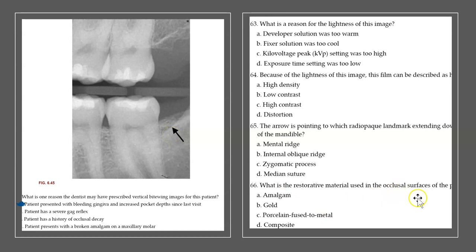Looking at the restorative material on the occlusal surface of the posterior teeth: the material is composite. Composite appears less radio opaque than amalgam or gold. Amalgam would be much more radio opaque. Gold would also be highly radio opaque. PFMs would be radio opaque with a porcelain component visible as well — none of which we see here. So this is definitely composite.